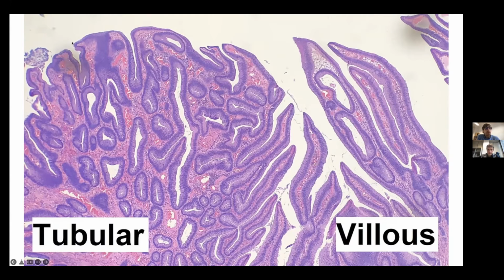Here you have a tubular adenoma, and here you have a villous adenoma, and the villous adenoma is characterized by this kind of finger-like protrusions. So it will be very difficult to distinguish this from this one if, for example, you would focus on high magnification images where you see just a small square of tissue. You have to get a broader view.